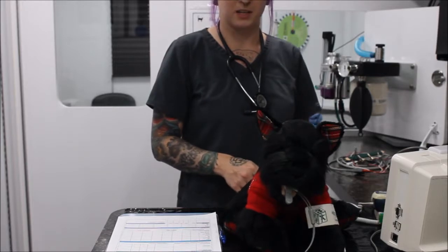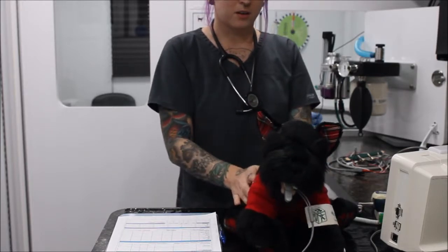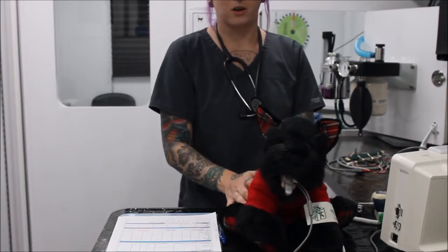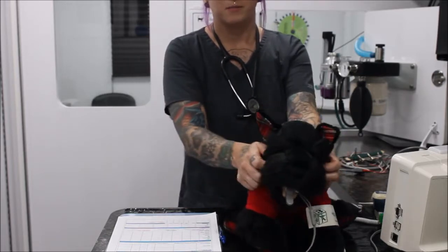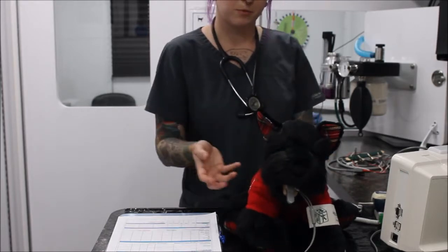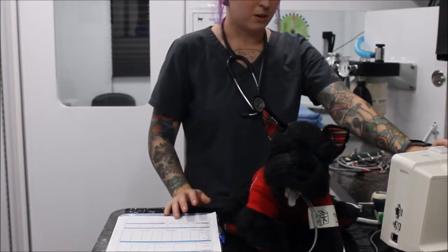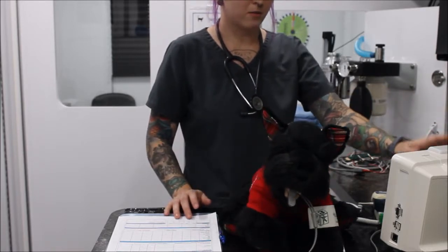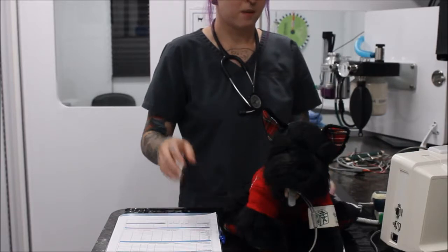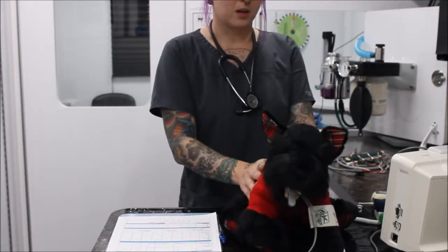We don't want any panting that might indicate there are going to be some issues. A lot of the time you also need to check your endotracheal tube, because the tie could be too tight and that can be causing some problems. I've seen that before. So we want to monitor our pattern through here, and then our report on our paper.